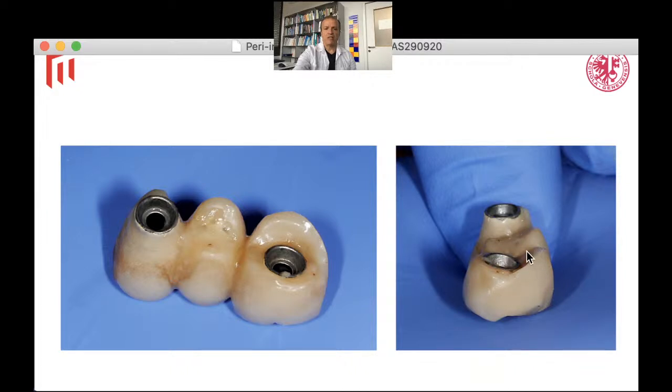And of course, you can imagine that in this aspect here, it's completely impossible to brush, even if the patient was the best brusher in the world. This aspect cannot be cleaned efficiently. So in this case, one has to modify the prosthesis. One has to take off the saddle, which I cannot explain why it was put there, because there is of course no reason for any aesthetic concerns in the molar aspect in the lower jaw.